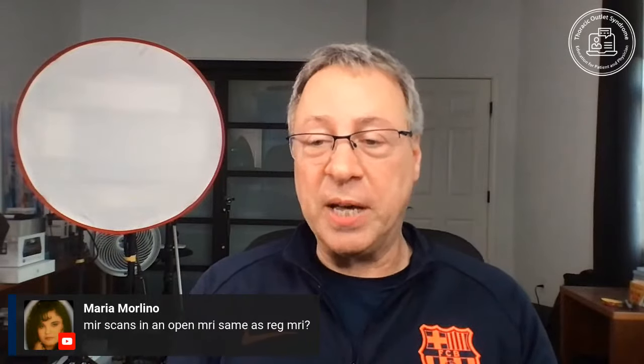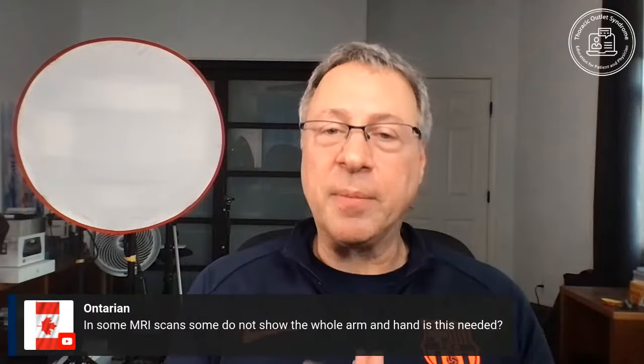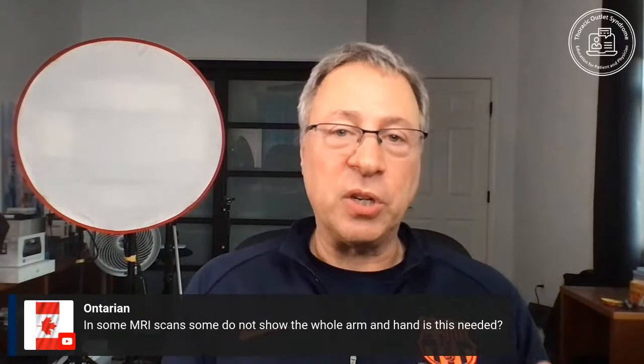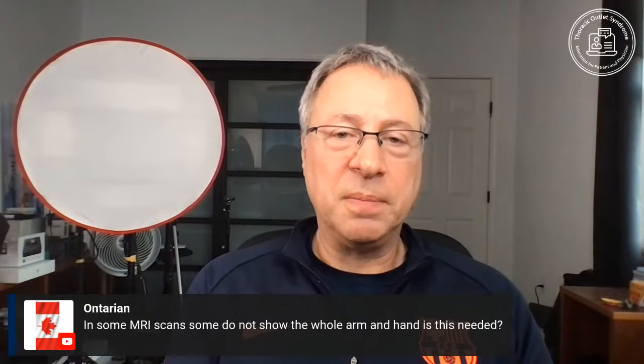Our next question says, some MRI scans do not show the entire arm or the hand. Is this needed? You could, with an MRI, show most of the body in one view. But again, like the resolution question of a low field or open MRI, you're going to lose the ability to see things up close.